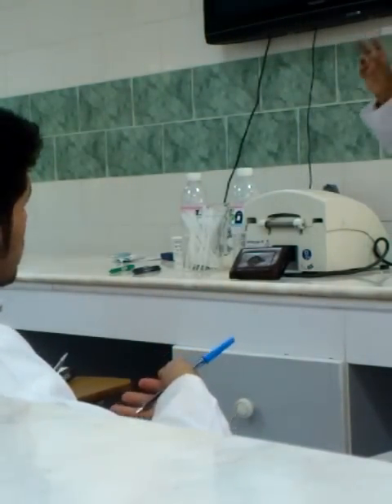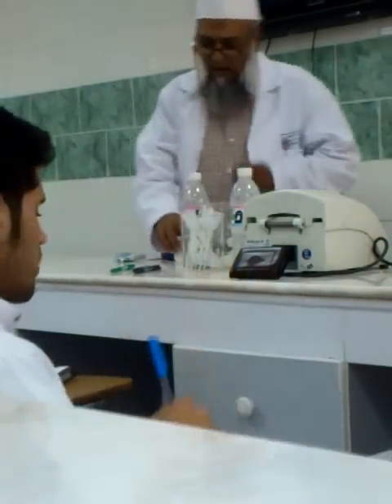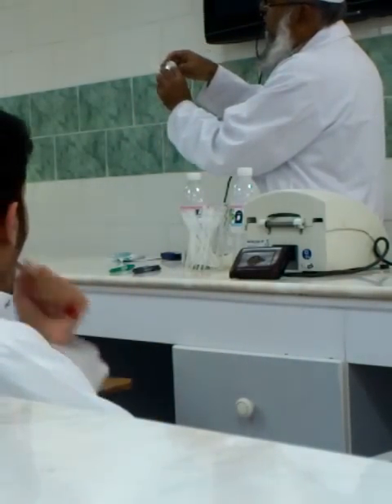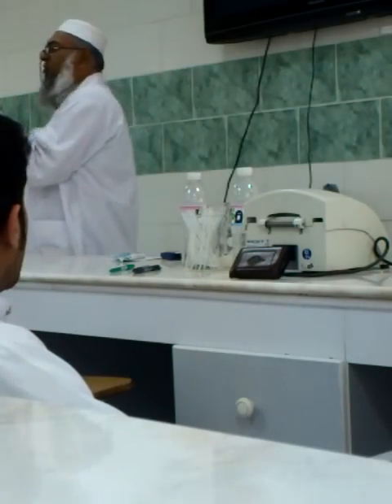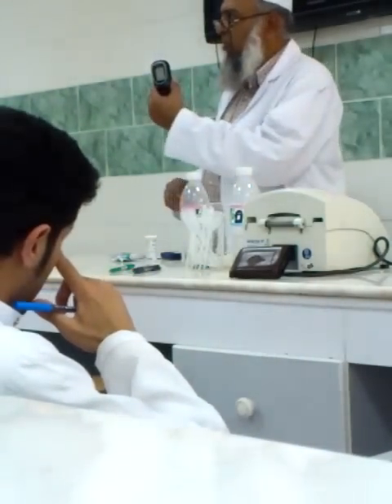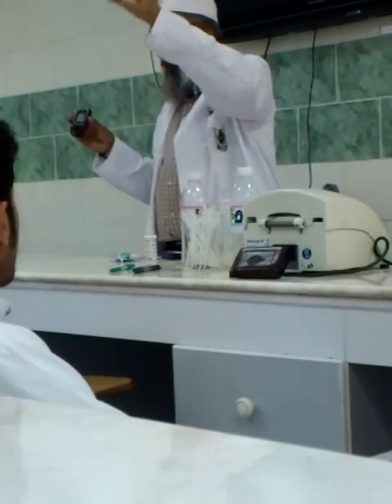On the box, the number of the coding chip will be provided. Like here it is written 385. So 385 is the number of the coding chip, which is also given here on the box. And whenever you start the glucometer, the first thing that appears on the screen will be the number of the coding chip, 385.